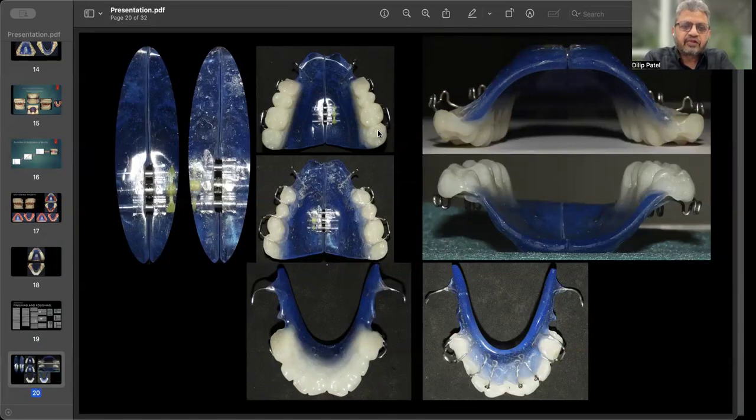The first picture will show how the meeting part of the upper appliance is finished. The separating line in the upper is also beveled so that as you expand the upper appliance, there is a gap, and many times the sharp edges of the upper bite block may irritate the tongue, as well as hurt the palatal mucosa also. So it should be beveled and finished well.